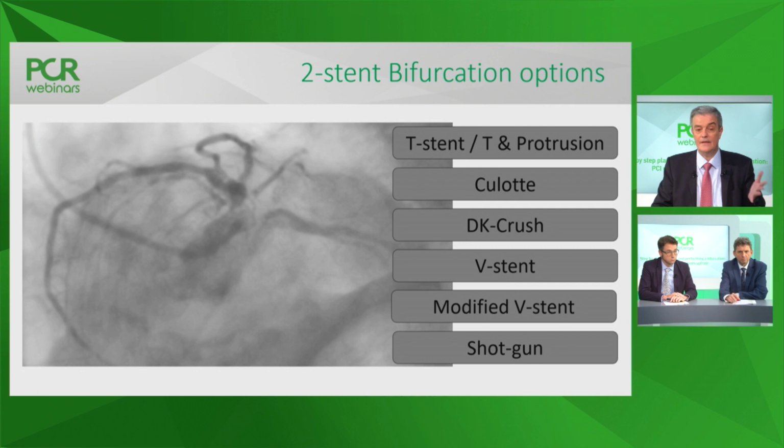Similar vessel size in both branches, circ and LAD. Favorable, large proximal left main to open and deploy both stents adequately. Another option that is also feasible when I look at this angle, and if I consider circ as a target lesion, is maybe inverted provisional T stenting from left main into the circ and then TAP, a second stent towards the LAD. In that case, you consider LAD as the side branch and circ as the main vessel. So many different options. Tom, what have you decided?